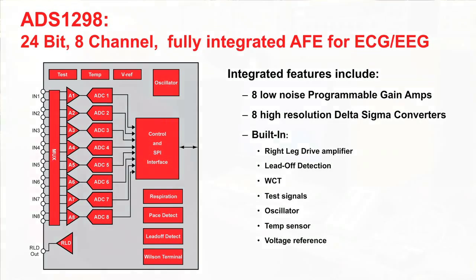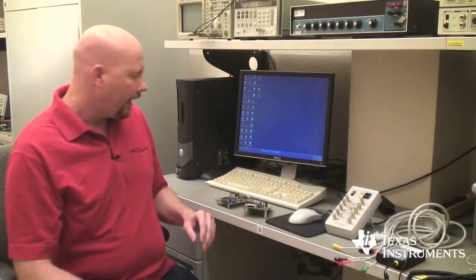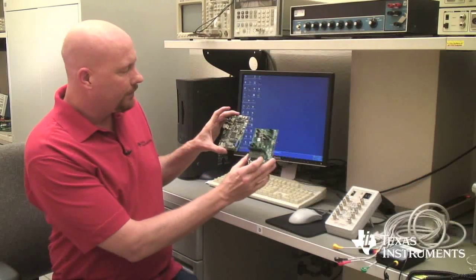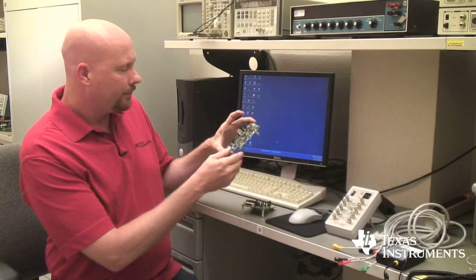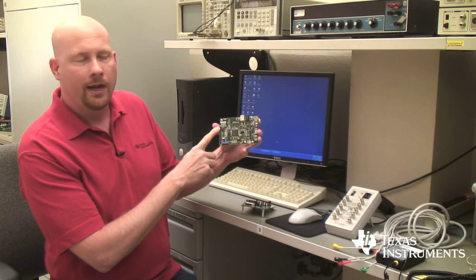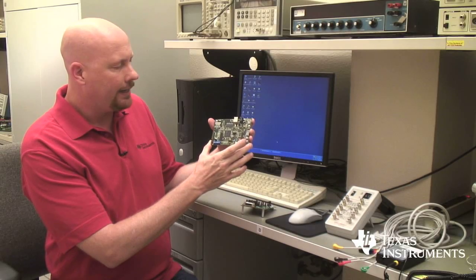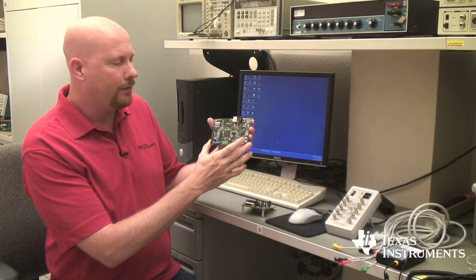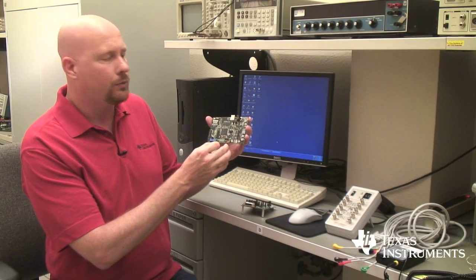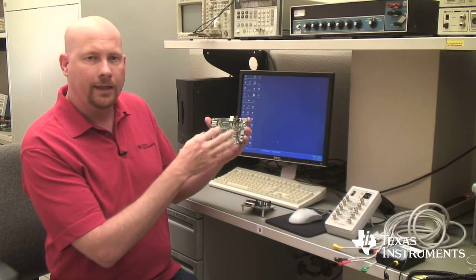When you get a PDK you're actually going to be getting two boards. The larger board is what is designated as the MMB0 board and this board has a TI DSP, a C5507, and it handles the interface for the data between the 1298 and the computer.